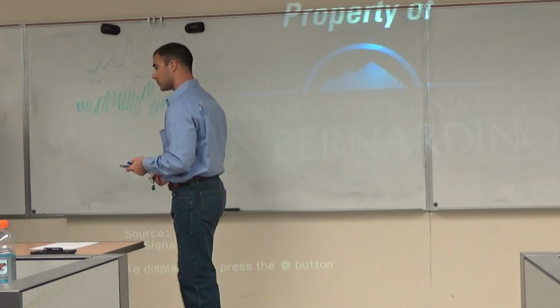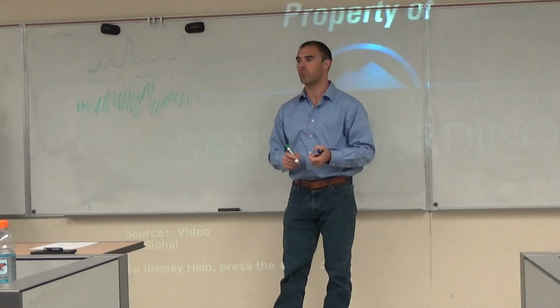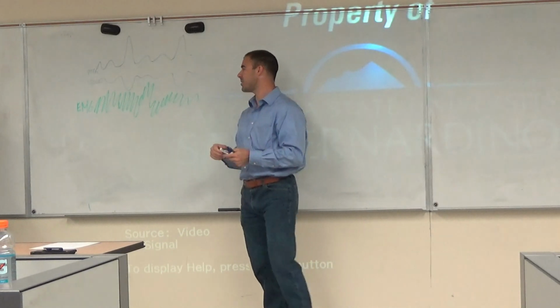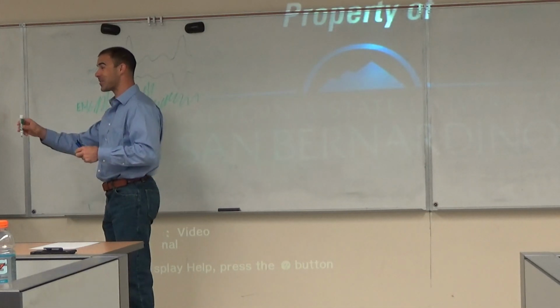We're just going over this. Good job. Okay, so what are some other ones? We'll give Kelsey a break. What's another artifact? EKG. Okay. So EKG, you know what that looks like? You want to draw that one for us? Okay.